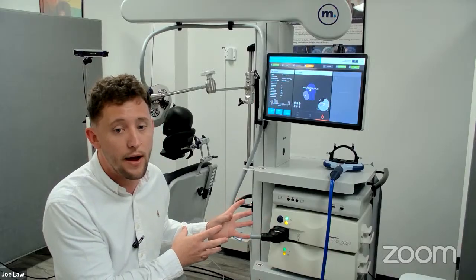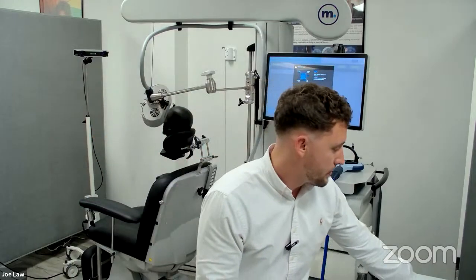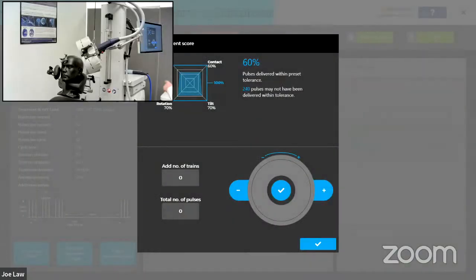This was something we did with the previous model of this. When it was released, we didn't have the clearance for OCD treatment. I believe it was 6-7 months later, we were then cleared. So we then pushed that indication and the workflow out to all of the systems out there that now could have that treatment. Okay, so the treatment is finished.